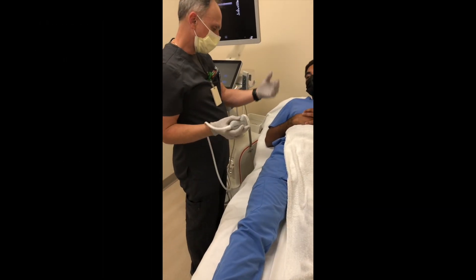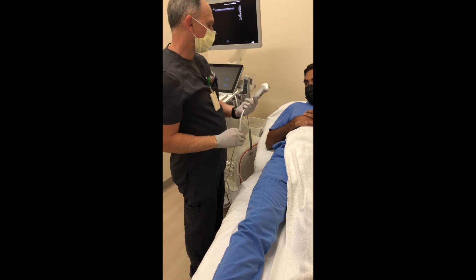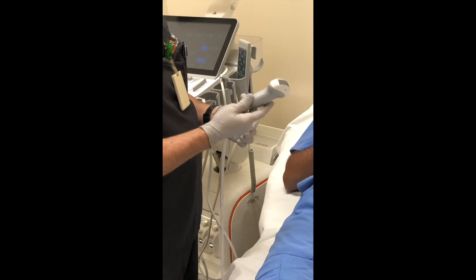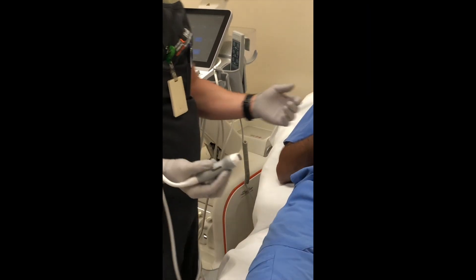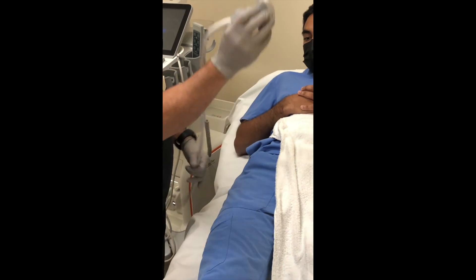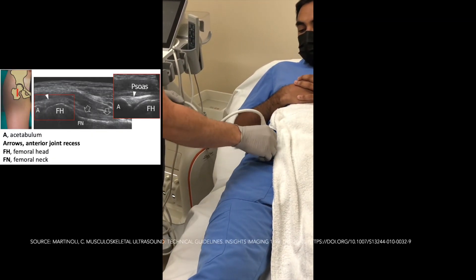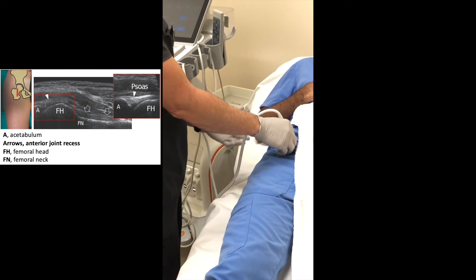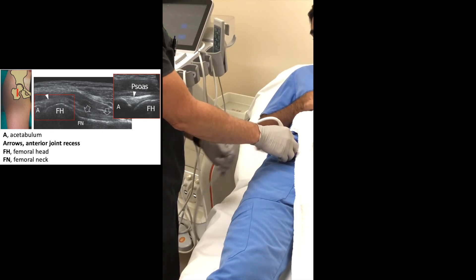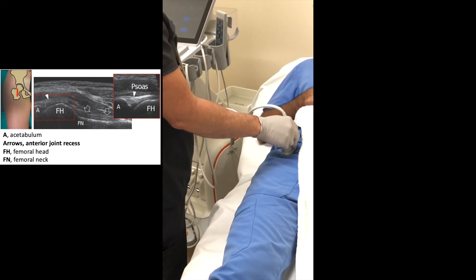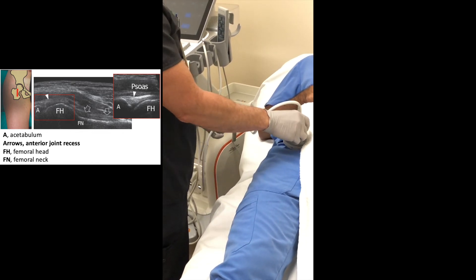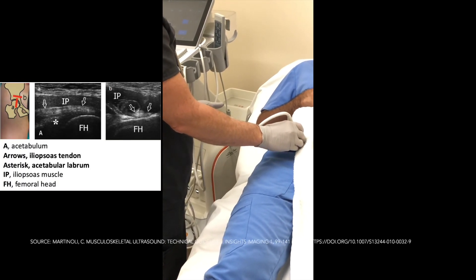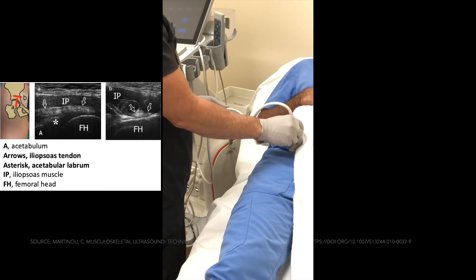We're going to do an evaluation of the hip, specifically intra-articular. Because it's a deeper structure, we like to use the convex transducer — the 5C1 is the probe of choice. We're going to start off long axis right on the femoral head, looking for labral pathology, effusion, and synovitis. We check the joint in long axis and short axis. Then I like to go a little bit more medial to the iliopsoas muscle and tendon, evaluating in both short axis and long axis.